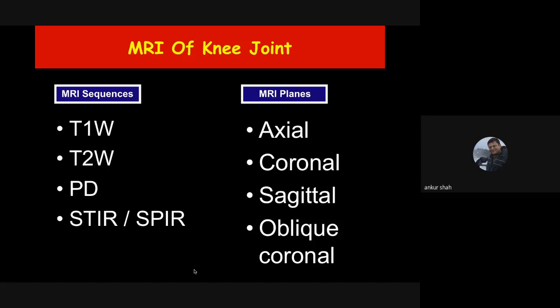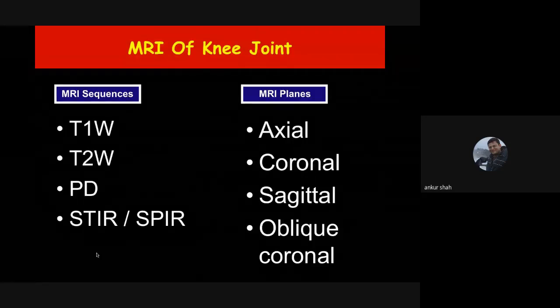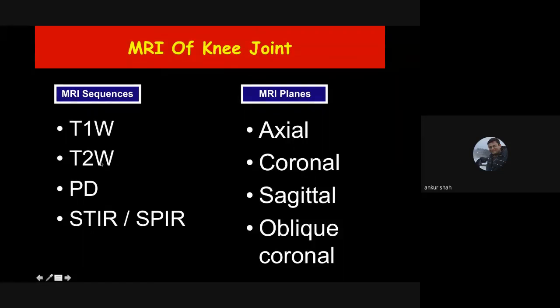Different sequences are used for the knee joint. The most important ones are T1 weighted, T2 weighted, proton density, and STIR or fat-suppressed images. These sequences are taken in different imaging planes: axial, coronal, sagittal, and sometimes oblique coronal, particularly for the anterior cruciate ligament.